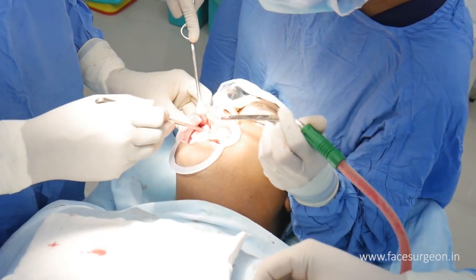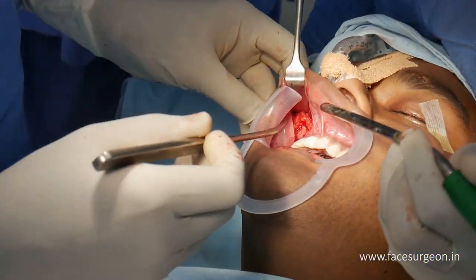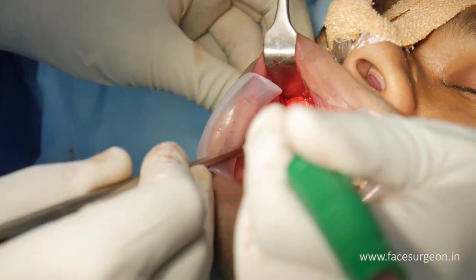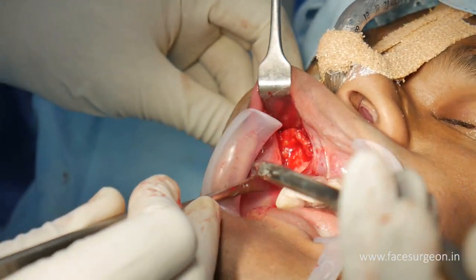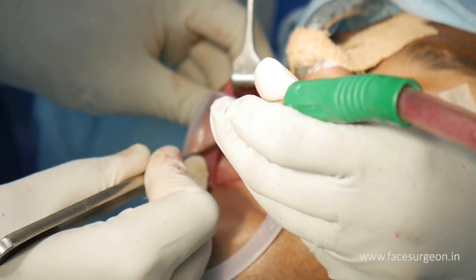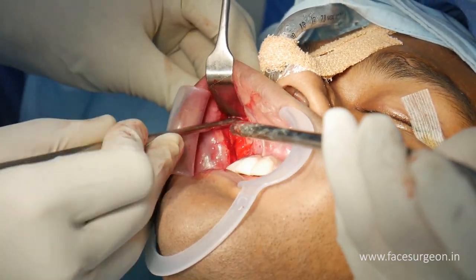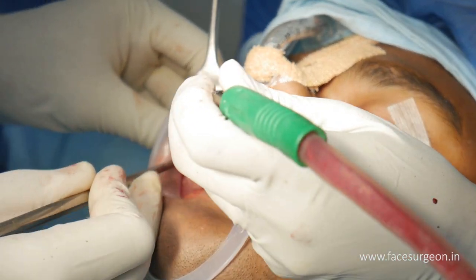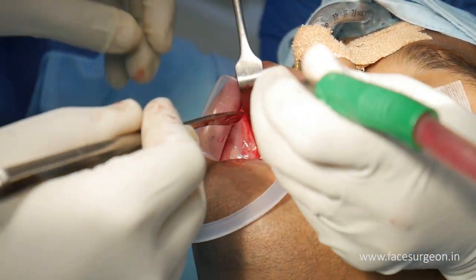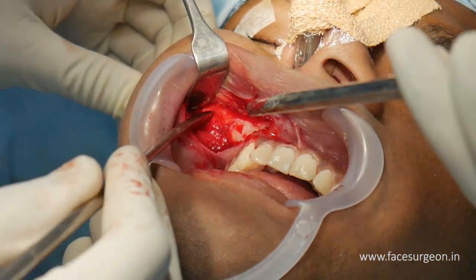This patient sustained a fracture some years ago. I'm going to show you the way the bone has healed there. You can see a small fracture line that's healed. There's this fracture line in the buttress also. So we're going to expose all of this and contour the cheek, partly bony, also partly soft tissue. Okay, I'm going to reach all the way. The malar bones, yeah, I can hold on to the head.